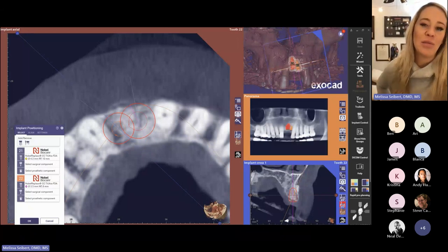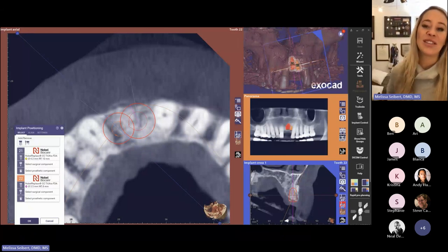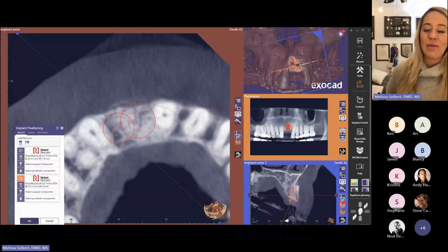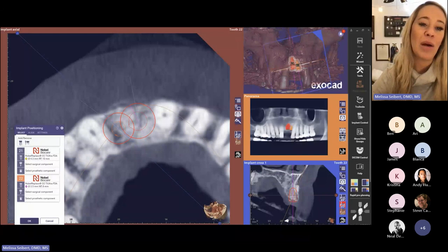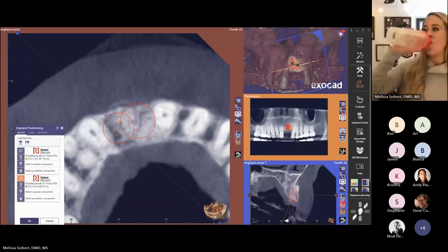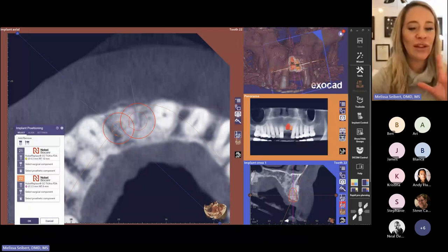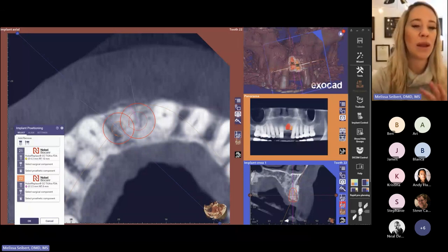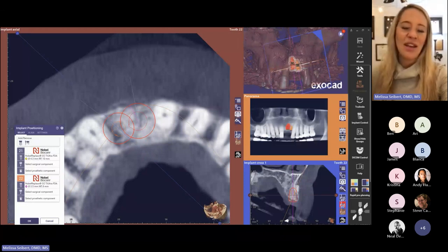What I did in the pre-planning feature was quickly place two implants of a reasonable size and brand. Right away, you can see there's just no conceivable way we're going to fit two implants in there — it lit up bright red. This is helpful because I'm able to talk to the patient about why two implants are not going to fit. The software lighting up like this makes it much easier to explain to the patient why we're making the decisions that we are, so they don't feel like they're being cheated out of a second implant.